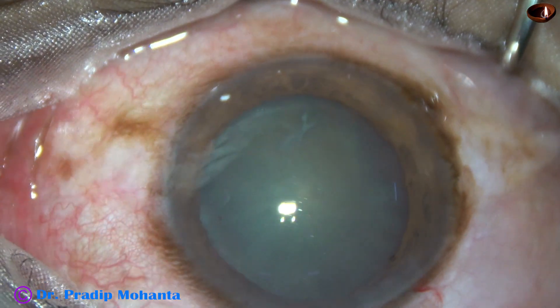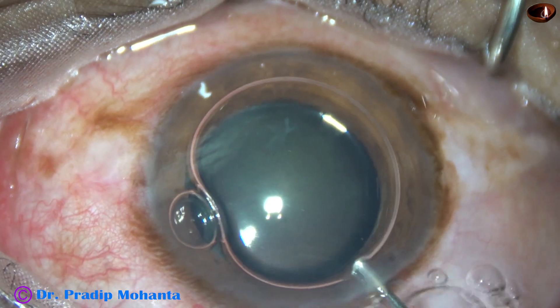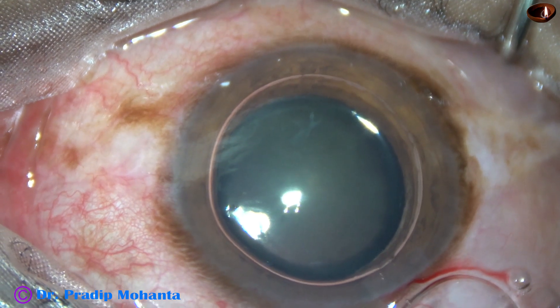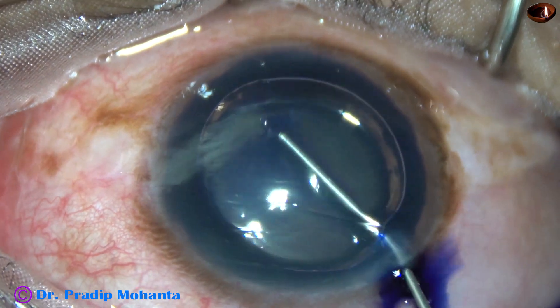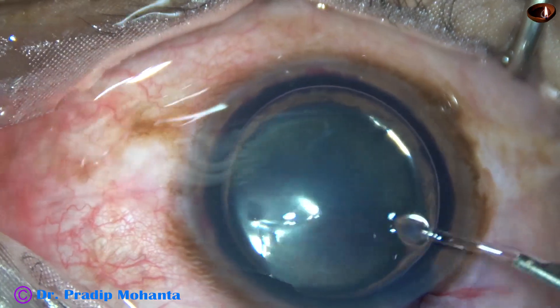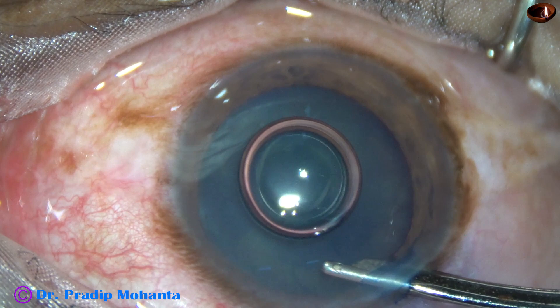An air bubble is injected into the anterior chamber. Beneath this air bubble, trypan blue dye is applied over the anterior capsule. The dye should touch all parts of the anterior capsule for uniform staining. Now the dye is washed out.